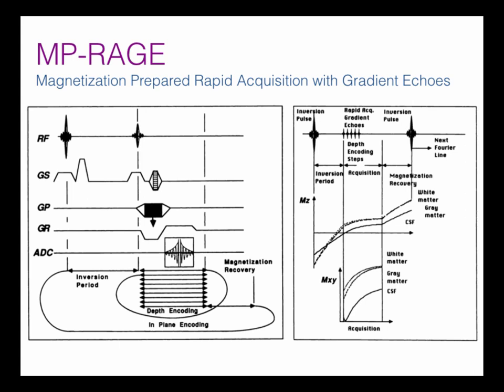Okay. So what this does is it allows you to acquire a nice image in about 5 minutes if you use this sort of method.